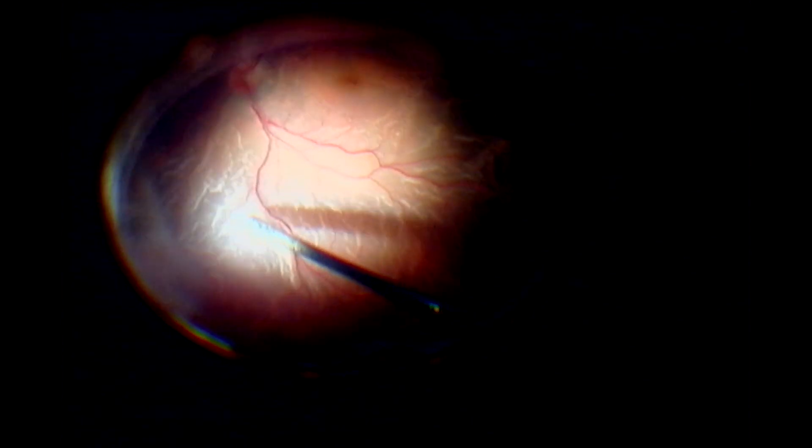That is the drainage retinotomy. You can see the air bubble coming in. I am draining the fluid with the cutter as well as the fluid cannula.